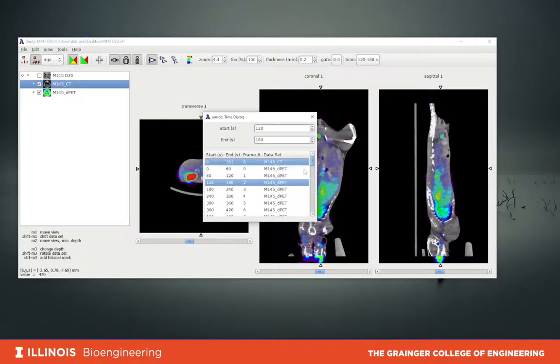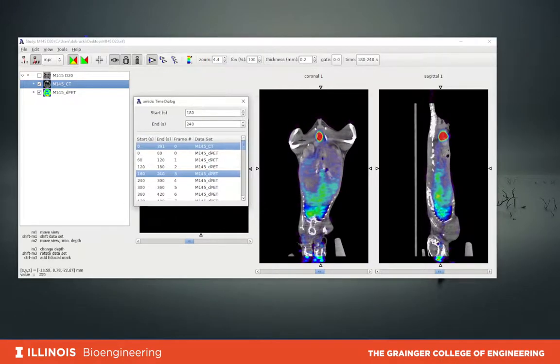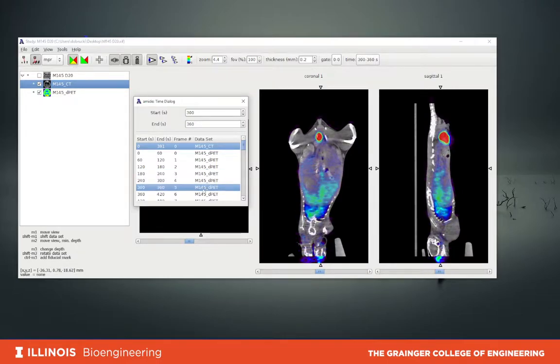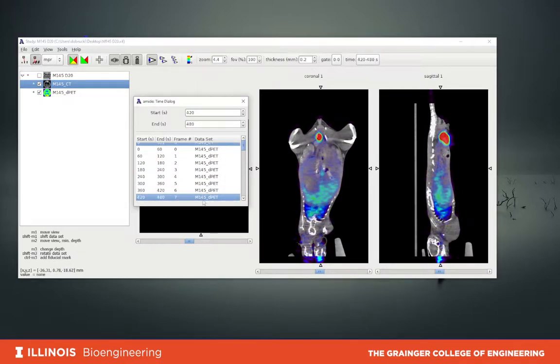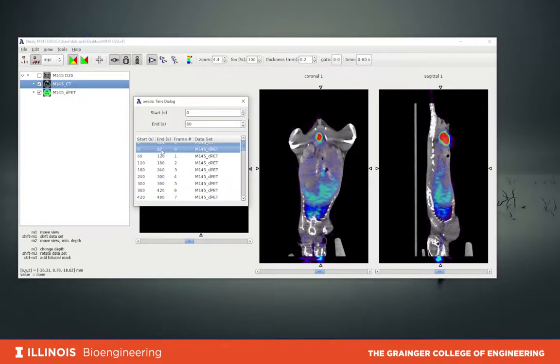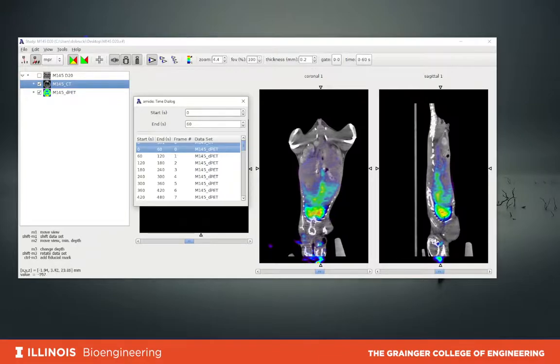When we click at different frames, our PET image over here changes. We can see the changes in the biodistribution of the radiotracer. When we go back to frame one, which is at the time of injection, most of the radiotracer goes to the heart — we can see the heart over here — and there is some radiotracer going through the vessels towards the rest of the body.